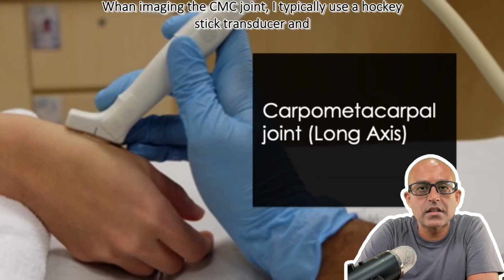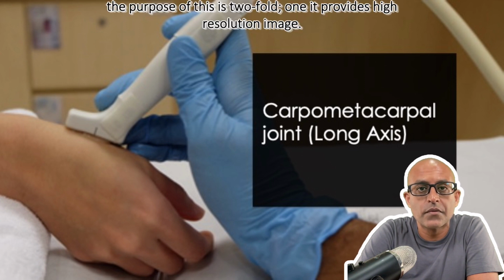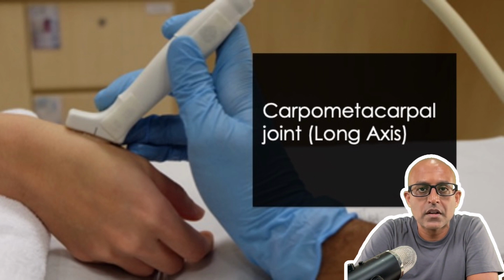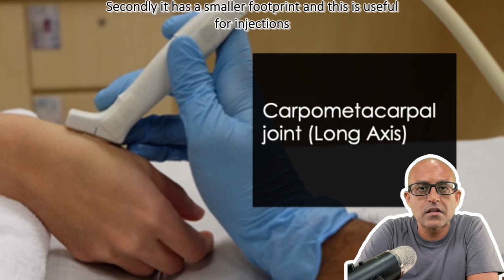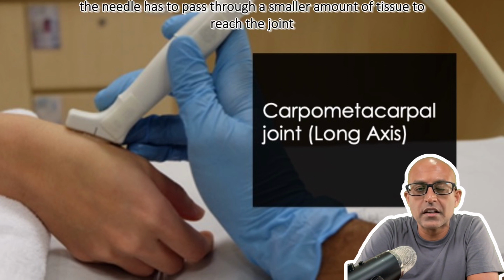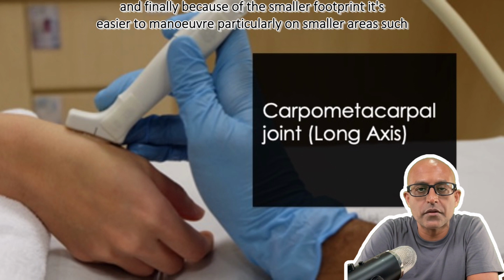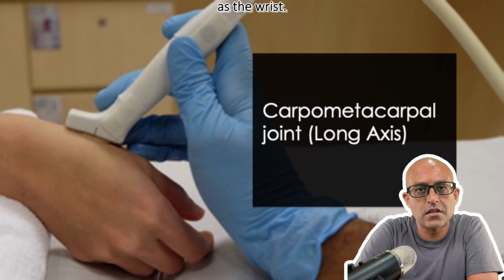When imaging the CMC joint, I typically use a hockey stick transducer. The purpose of this is threefold. One, it provides high-resolution imaging. Secondly, it has a smaller footprint, and this is useful for injections, meaning that the needle has to pass through a smaller amount of tissue to reach the joint. And finally, because of the smaller footprint, it's easier to maneuver, particularly on smaller areas such as the wrist.